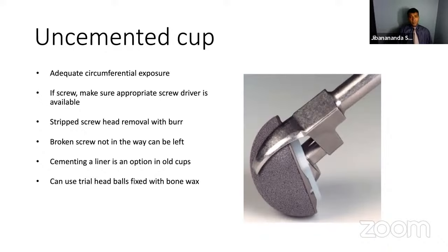What you need: typically good exposure, circumferential exposure. Make sure you have the appropriate screwdriver. Many uncemented cups, obviously, have screws. If there are screws, make sure you have an appropriate screwdriver. This can be a pain otherwise. If you strip the screw head, it really adds time to your surgery.